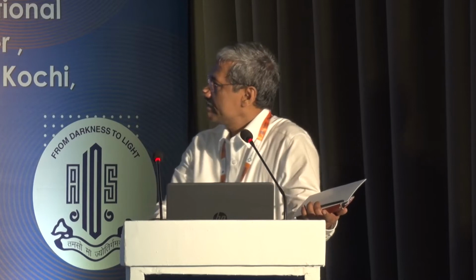and it derives a K from that. And if you look at those points, they're there in 3 concentric circles. So each of those circles has 6 points.